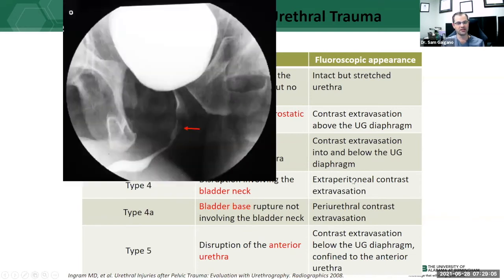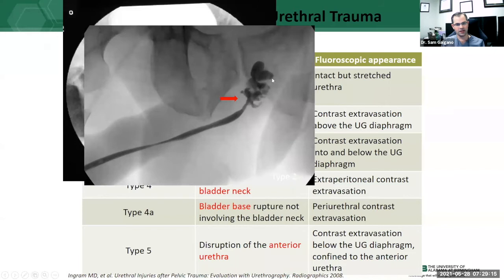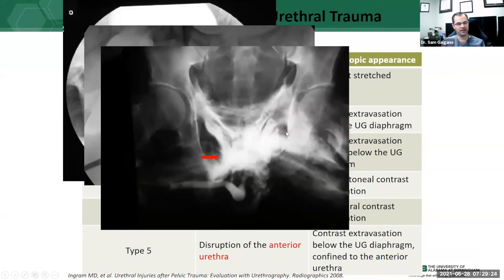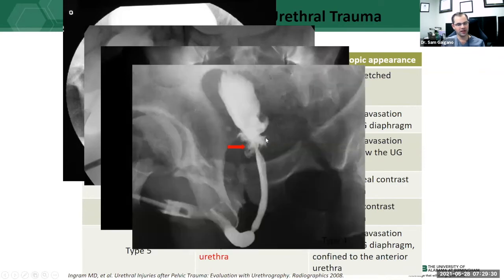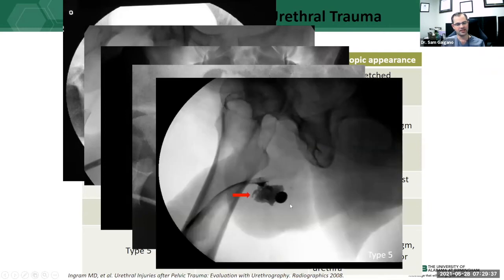Image examples of all five types: type one shows a somewhat elongated and irregular stretched urethra — technically challenging to diagnose. Type two shows extravasation above the urogenital diaphragm but not below. Type three shows extraperitoneal contrast below the urogenital diaphragm. Type four shows extravasation at the bladder neck where the urethra inserts into the bladder. Type five shows a large leak in the mid portion of the penile urethra — a clear anterior urethral injury.